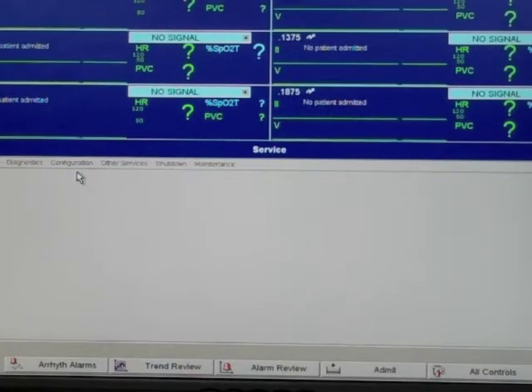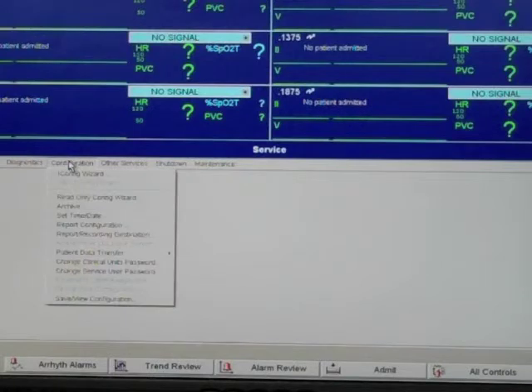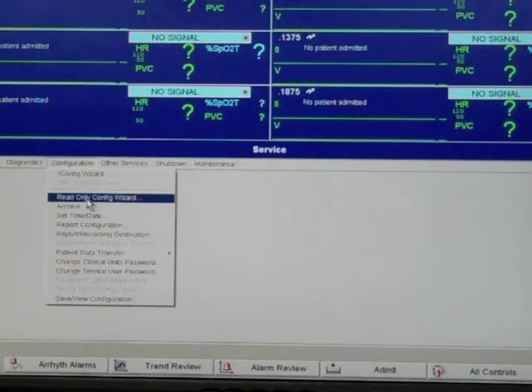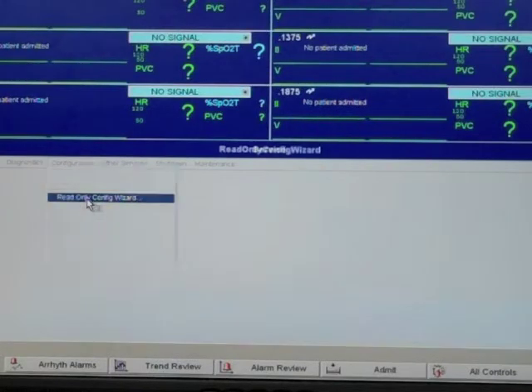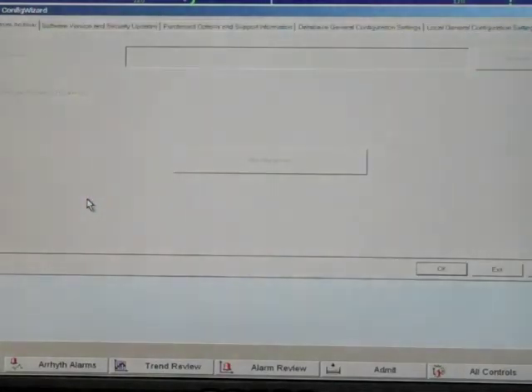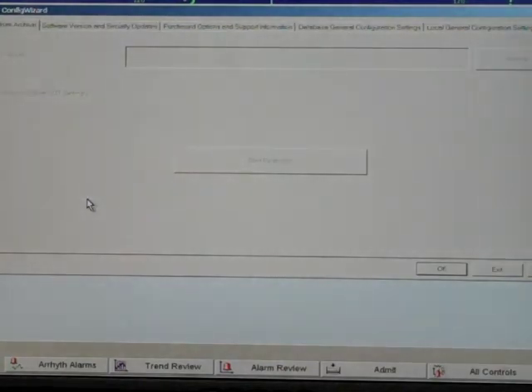On the following screen, click on configuration and in the drop-down menu select read-only config wizard. This mode will allow you to view the system settings without removing it from monitoring mode.